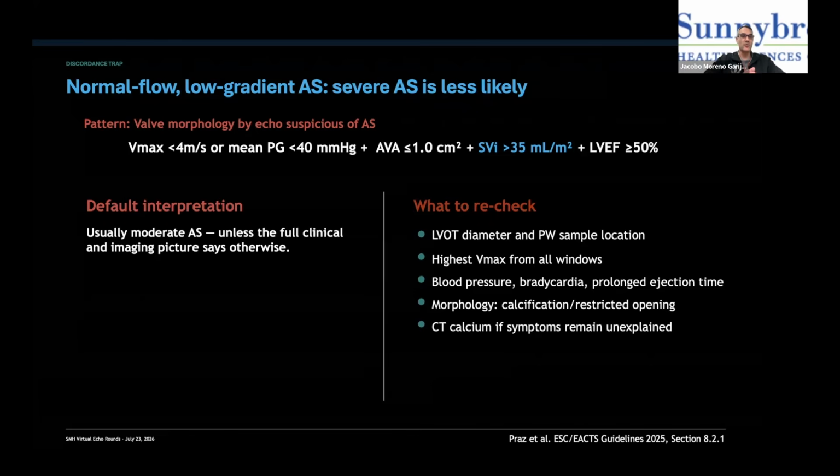But then you want to definitely recheck. Is my LVOT diameter taken appropriately? Was my pulsed wave Doppler in the LVOT exactly measured at the level of the LVOT diameter? Was I able to get the highest Vmax from all the windows? How much was my blood pressure? Was the patient bradycardic? Was there a prolonged ejection time, right? And then what was my calcium score? Those are things that can actually help you to make the final diagnosis here.